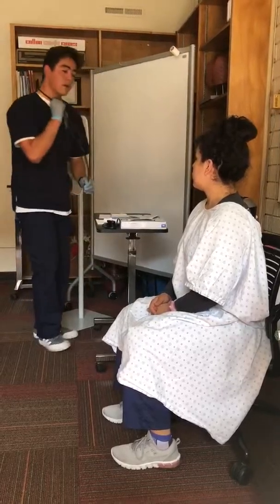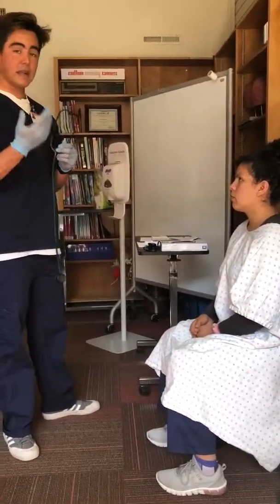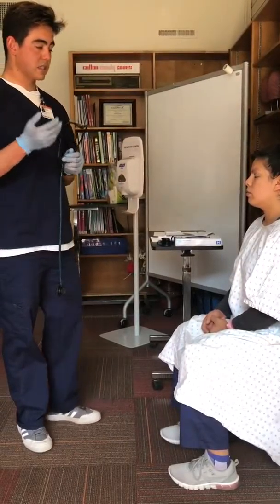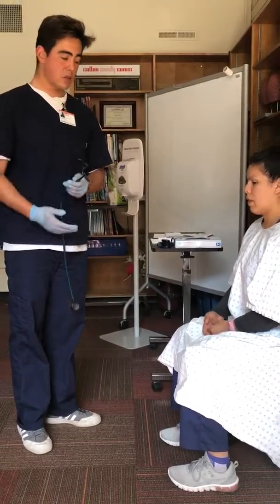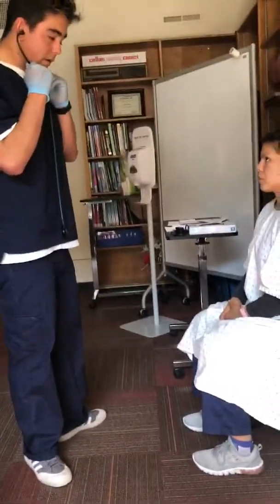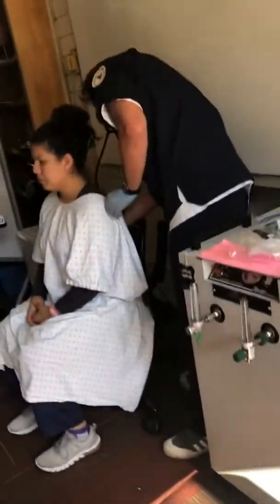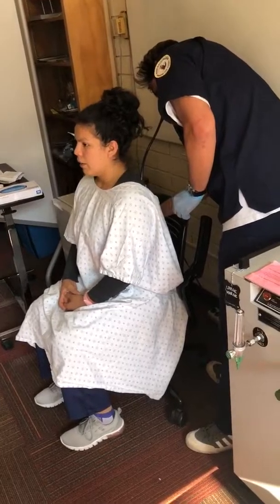Also, we want to note rate, rhythm, and quality for the respirations as well. Any other signs of trouble breathing, such as nasal flaring or any tripoding, any other accessory muscle use. None noted right now. So I'm going to go ahead and start those lung sounds on your back, okay? Okay. Big deep breath. Thank you.